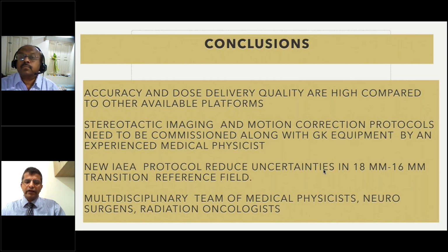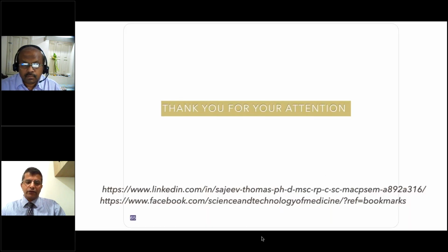The new IAEA protocol reduced many of the uncertainties for the transition, because previously, going from 18 mm to 16 mm, as well as different chambers, different positions, and the transition to the reference field were reduced by the new IAEA protocol. However, a multidisciplinary approach, a team approach, is very critical in the success of radiosurgery treatment. Thank you for your attention.